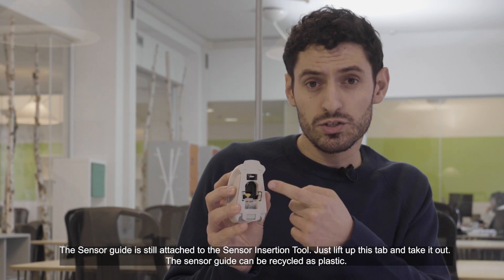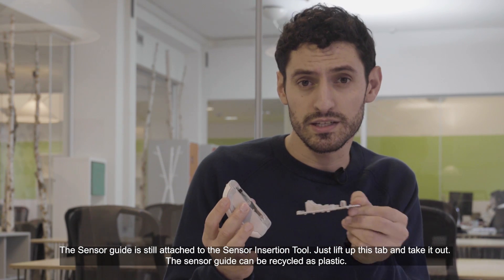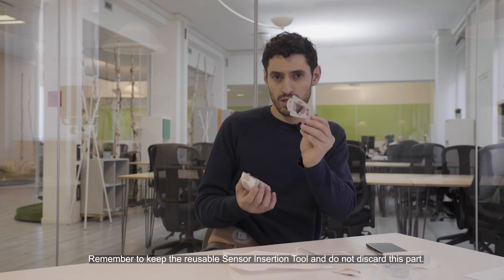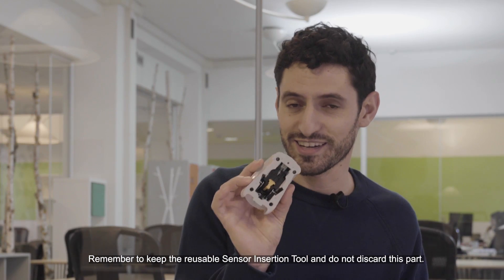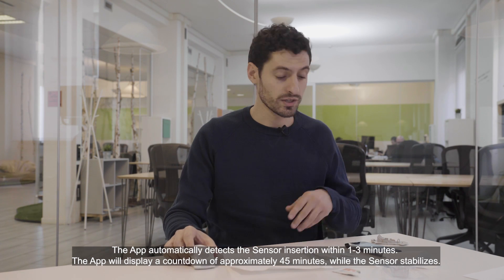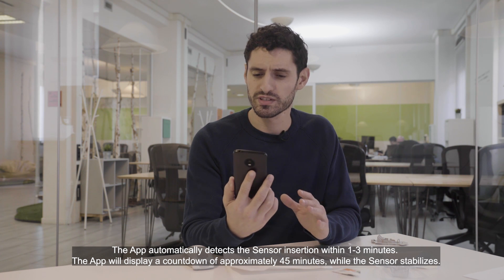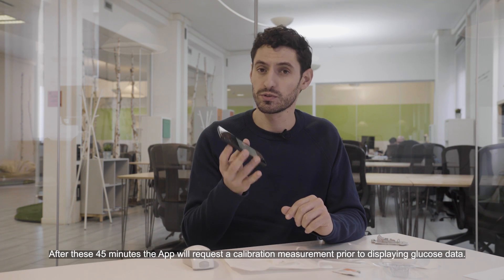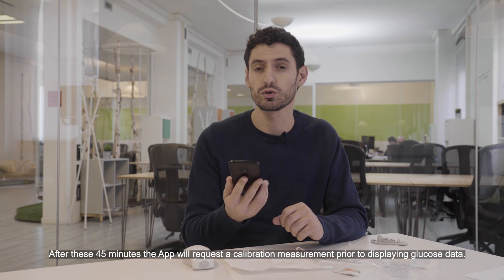The sensor guide is still attached to the sensor insertion tool — just lift up the tab and take it out. The sensor guide can be recycled as plastic. Remember to keep the reusable sensor insertion tool and do not discard it. The app automatically detects the sensor insertion within one to three minutes and will display a countdown of approximately 45 minutes while the sensor stabilizes. After these 45 minutes, the app will request a calibration measurement prior to displaying glucose data.